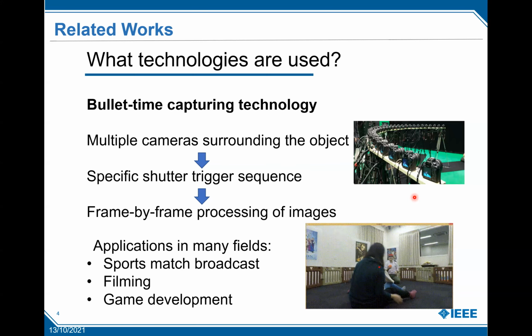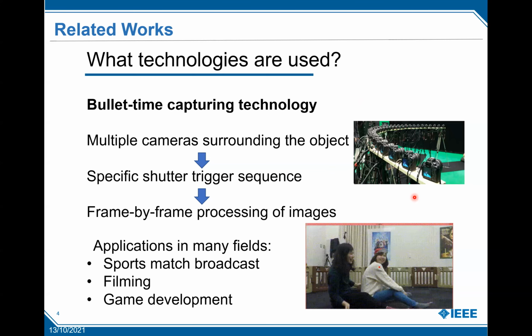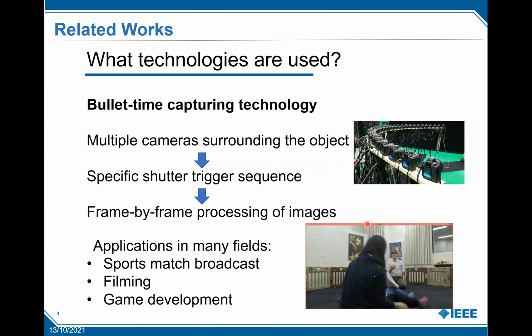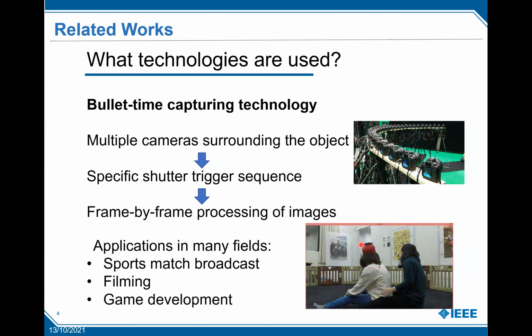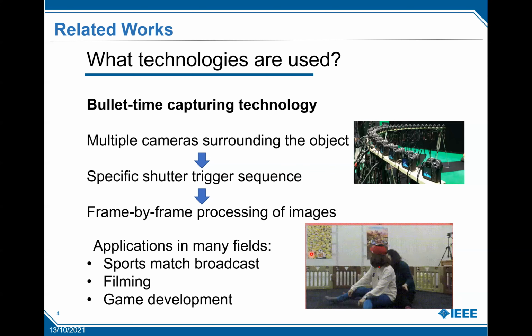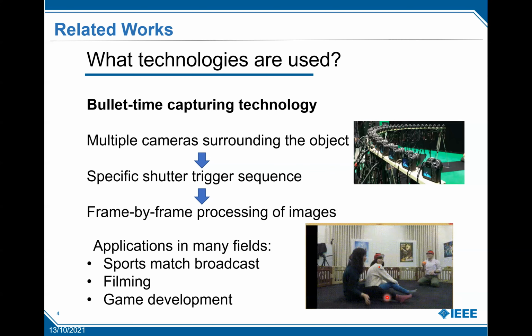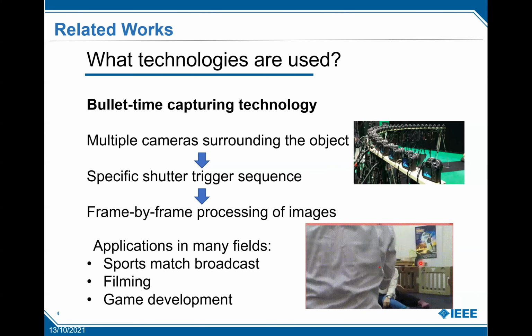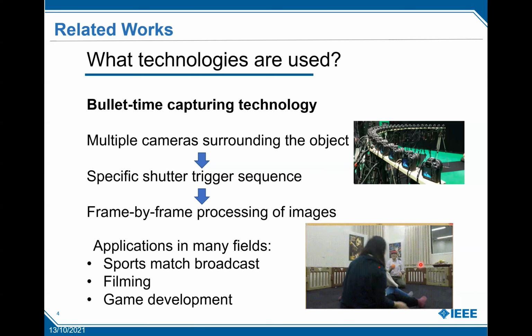It allows for the avoidance of obstacles in the shooting path of a single camera by designing a good trigger sequence. And combining the photos taken by each camera can form a perspective rotation effect on a stationary object or a super slow motion effect, just as the demo bullet time video shows. In theory, the virtual camera can achieve unlimited viewing angle and frame refresh rate.